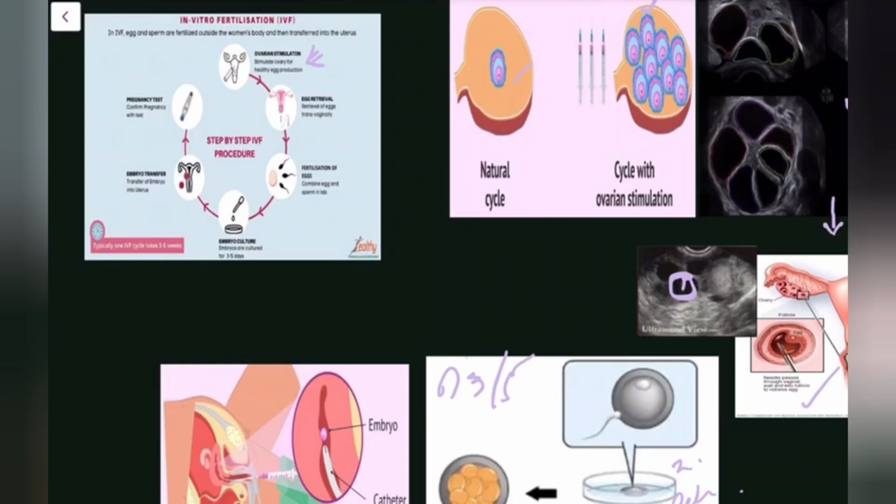So we understood that the whole game of infertility is to track these follicles. Where is the role of the radiologist? The role of the radiologist comes in tracking the follicular growth and making the fertilization happen once ovulation happens. So this is the whole crux of female infertility, where the radiologist comes into play. So now let's discuss the why of follicle monitoring.